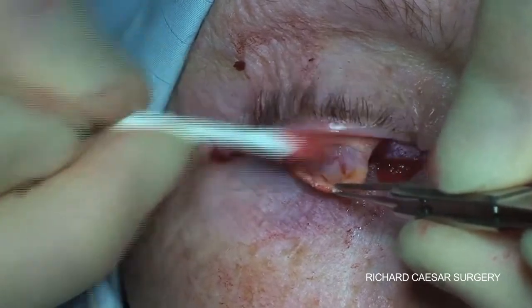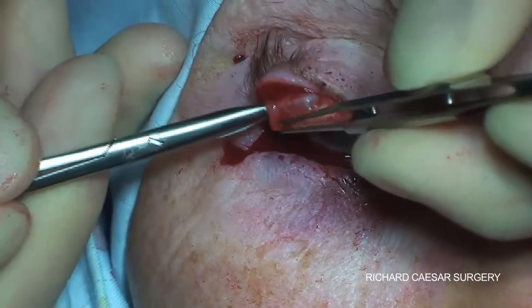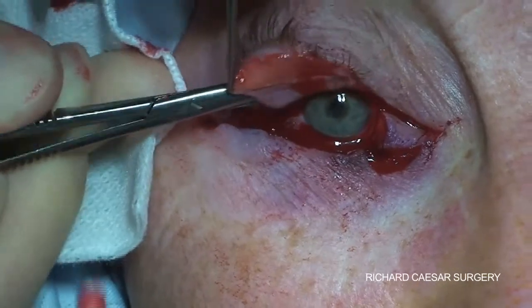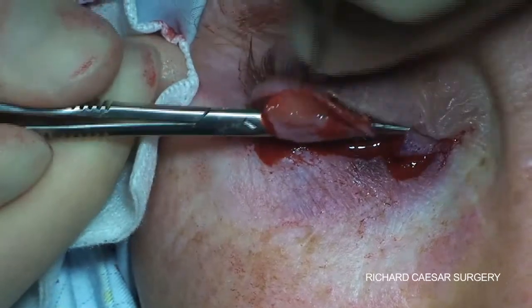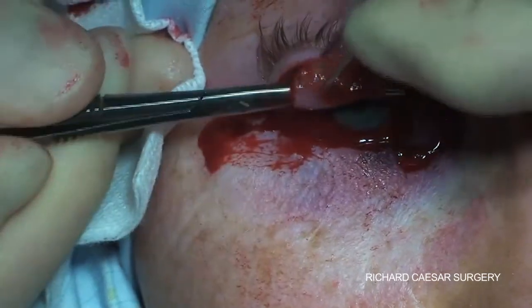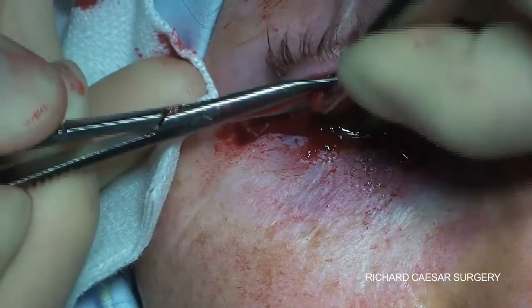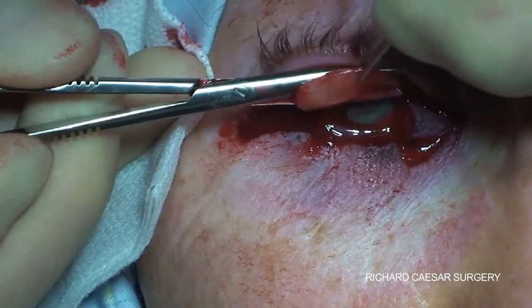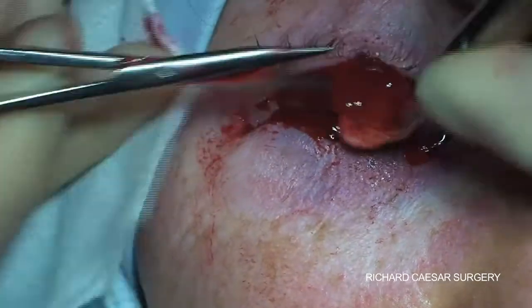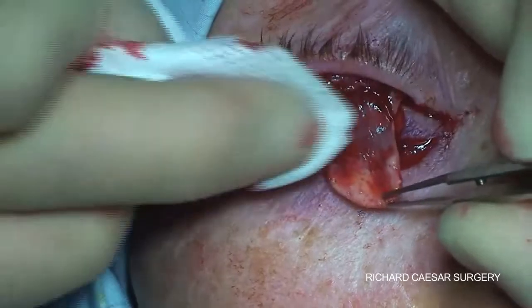You can then push back to reveal the conjunctiva and Müller's muscle. By tucking in between the conjunctiva and Müller's with the closed scissors and pushing medially, you can create a path separating the conjunctiva and Müller's absolutely from one side to the other. You then tuck the scissors back with one blade in this plane and the other blade out, and then you can snip off the Müller's leaving the conjunctiva intact. You don't want to do too much cautery at this stage as you want healthy vessels in the conjunctiva coming down.